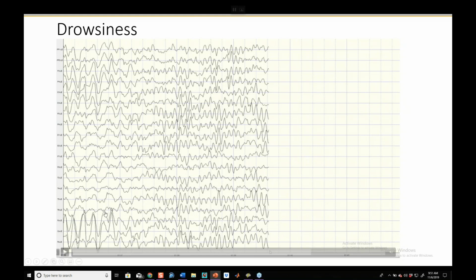They're drifting into NREM2, and they're soon going to make it into NREM3, and we're going to see the beta spindles start to give up and then some more delta show up in the record. But we have theta running down the midline. So this kiddo, in this case, is certainly falling asleep.